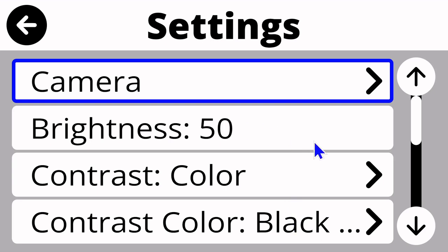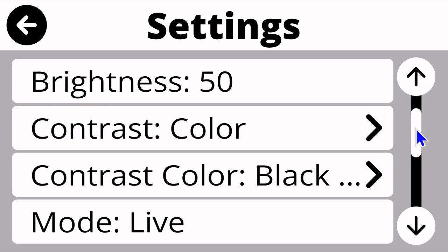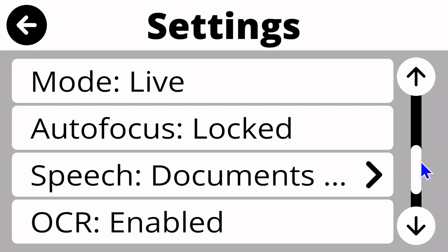So again, here are my settings. I already have a camera. I'm fine with my other settings as they are currently set up. I'm going to click and drag down just to remind you at the bottom of the list are settings that I'll want to use when I'm performing captures. Recall we're in a live mode right now. In a live mode, as we were just viewing a moment ago, we will only capture one page at a time. When we cancel out or save our document, we will return to our live magnification mode.